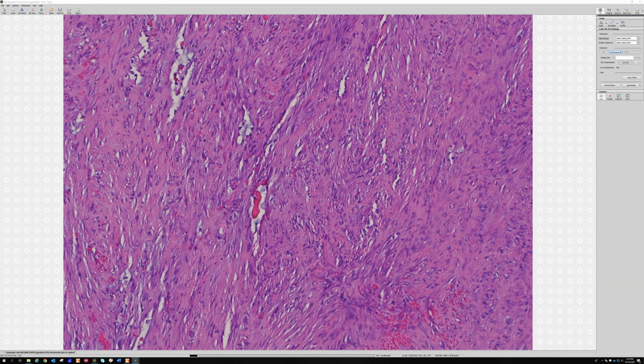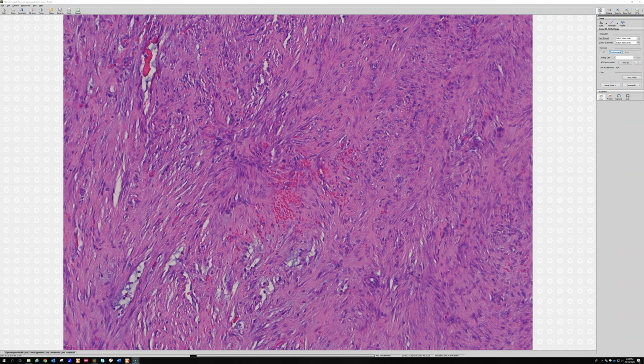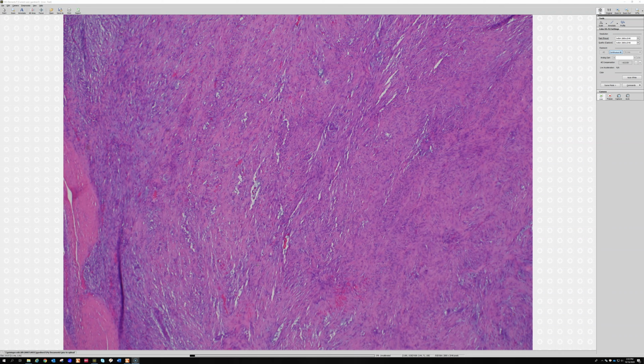And sometimes you see keloidal collagen, multinucleated giant cells, red cell extravasation. I don't personally find that helpful, but I know a lot of people really like to see that, and it is usually present. And usually nodular fasciitis is a small lesion, 3 centimeters or smaller usually.